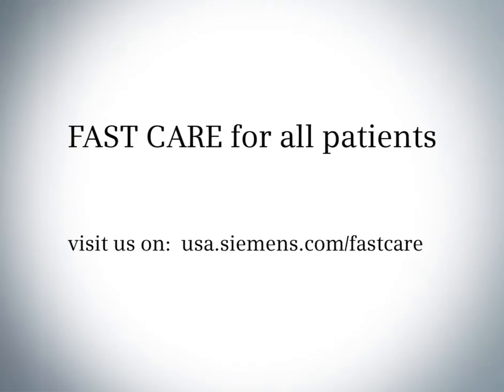This concludes the brief introduction to both FAST Care, fully assisting scanner technologies, as well as the enhanced Care or combined applications to reduce exposure features.